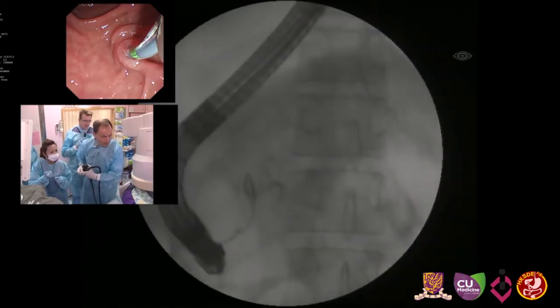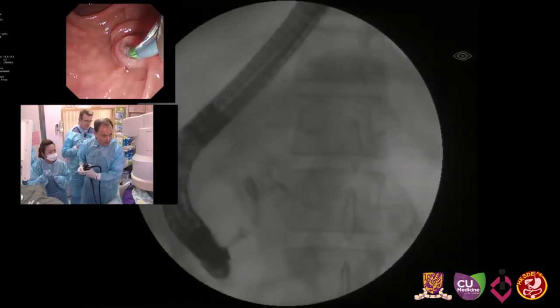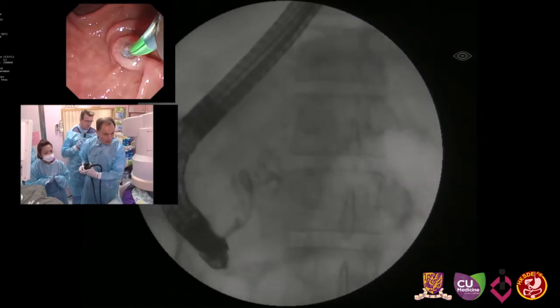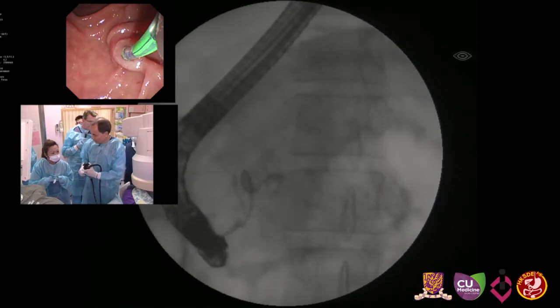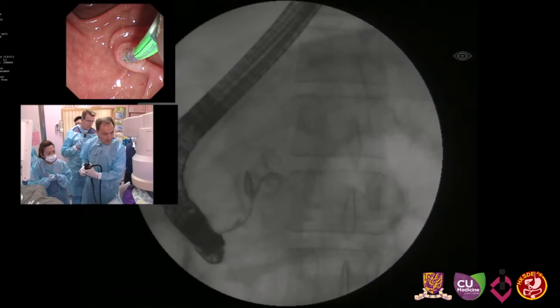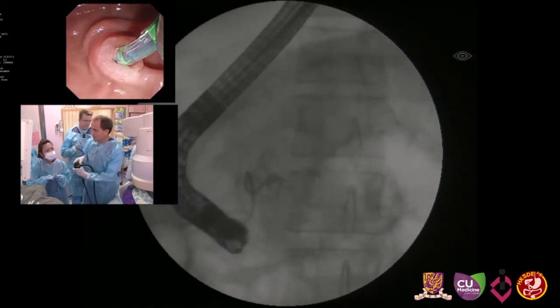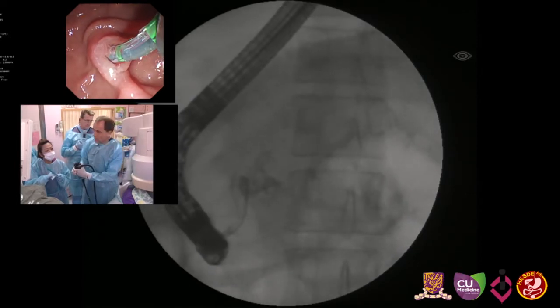The sphincterotomy, the advantage is you shorten the distance to the stricture and the stone. The disadvantage is that the contrast study is not as good because the contrast gushes out. So you cannot push the wire more forward, even with a loop? Maybe it's in the side branch. So I pull the sphincterotome back now. So push the wire slowly a little bit forward.